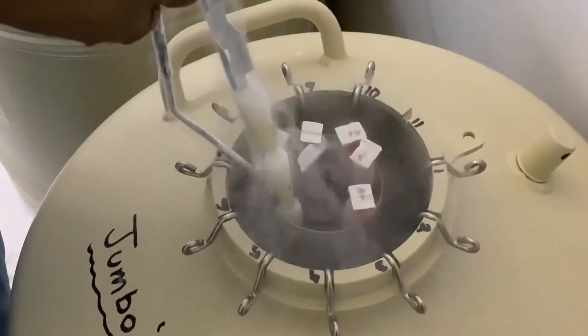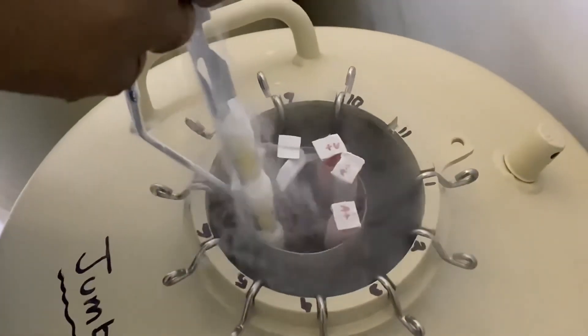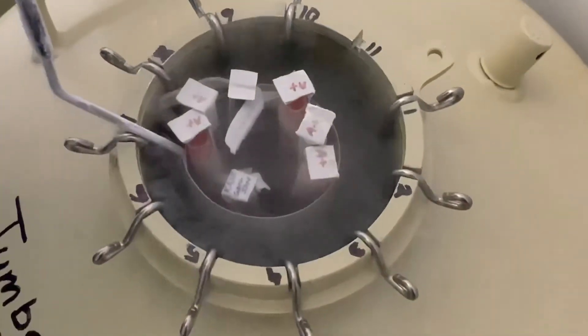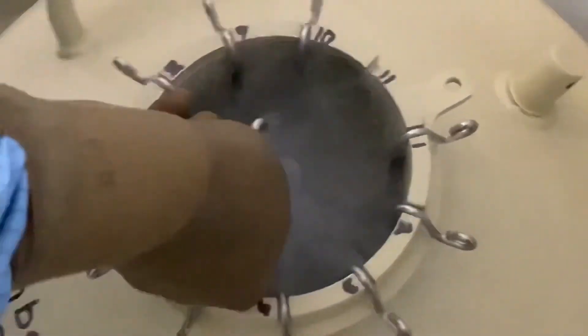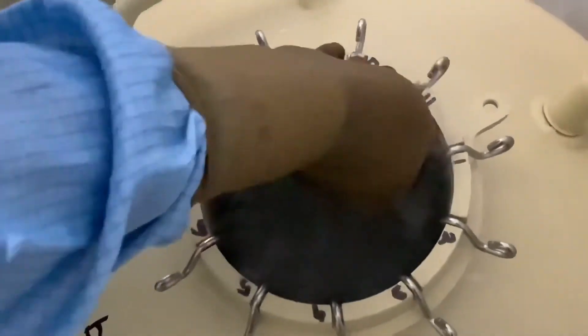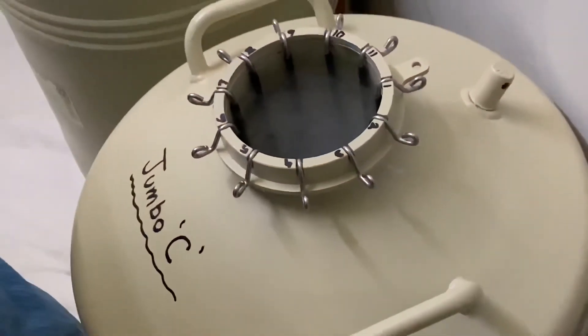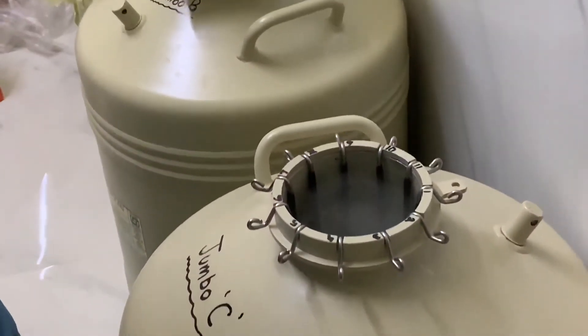Now the semen is properly frozen in liquid nitrogen temperature vapor at minus 80 and it will be plunged now inside the liquid nitrogen. And we will be keeping for years if needed this particular semen inside the liquid nitrogen at minus 196 degrees centigrade. This is a cryo can which we can see here in the cryo lab.